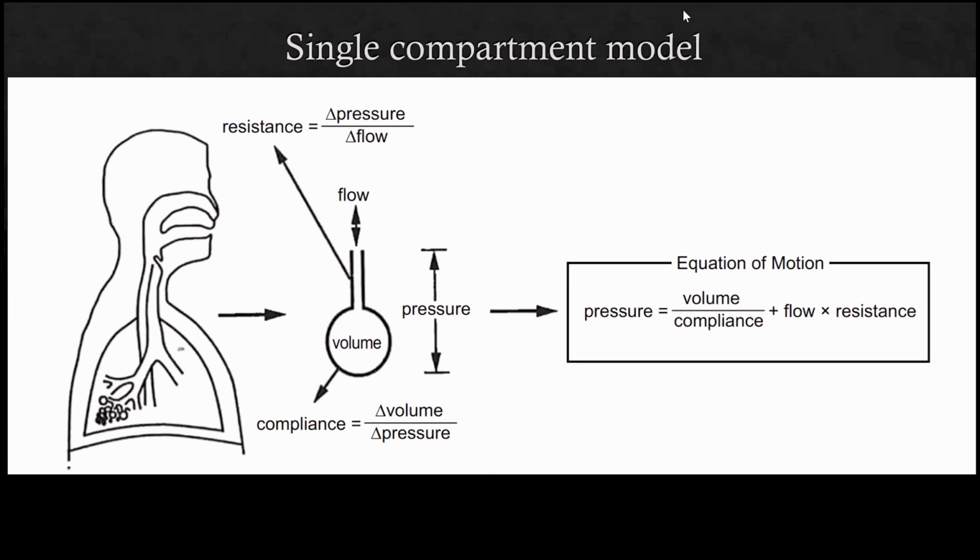What we need to understand is that when we talk about respiratory physiology in a ventilated patient, it is the entire system that we need to understand. So the basic equation of motion is the amount of work done to overcome resistance, which is the pushing of air into the respiratory system and the tubings. Which of course has its own components of flow, the bronchoconstriction, etc., and even probably the length of the tubing, which contributes to the dead space, and of course the compliance.